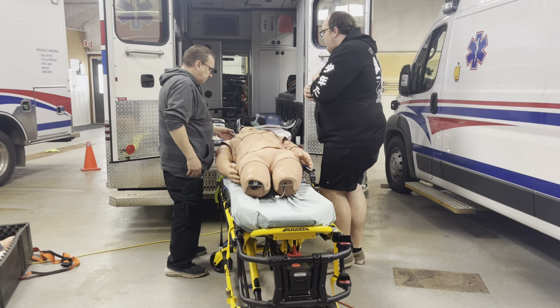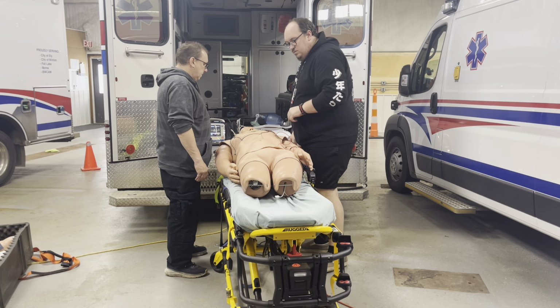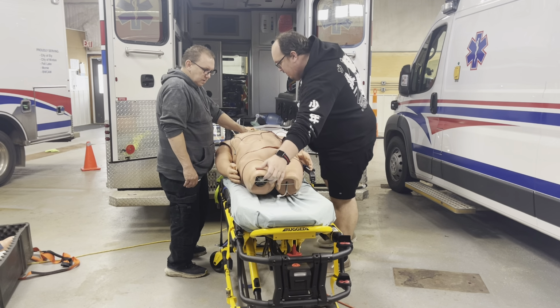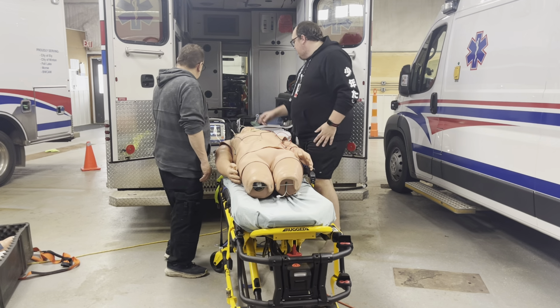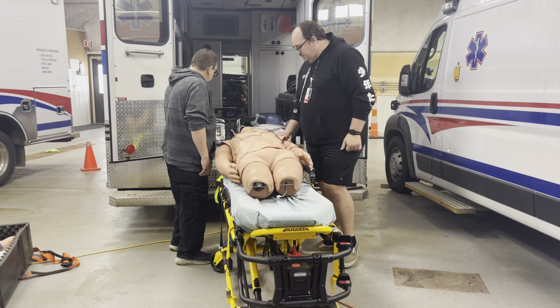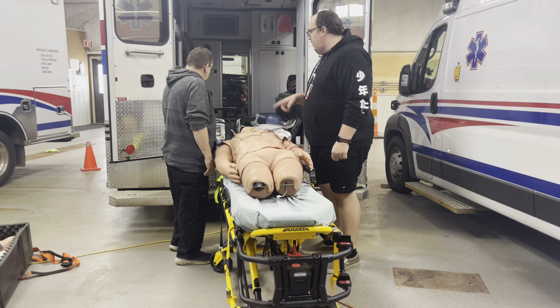Okay, so you have a patient who is bradycardic and he's just laying in bed right now, complains that he's super weak. You arrived and you've already put the 4 lead on your patient, and this is what you see on the monitor so far. So, what else do you want to do once you find your patient sitting here?